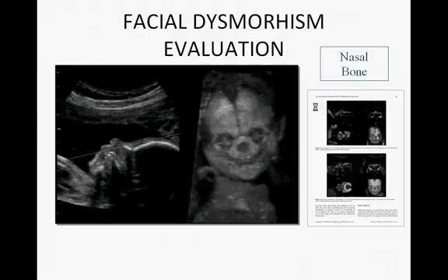the facial dysmorphism evaluation. Look for the sutures, nasal bone, the orbits. We can evaluate a hypotelorism or a hypertelorism. Look for micrognathia. Look for the ears. So a facial dysmorphism evaluation in frontal and profile side views can be very helpful, can be a vital clue in the evaluation of certain syndromes.